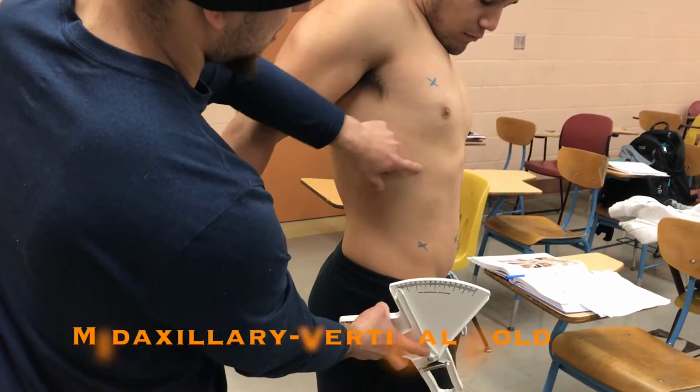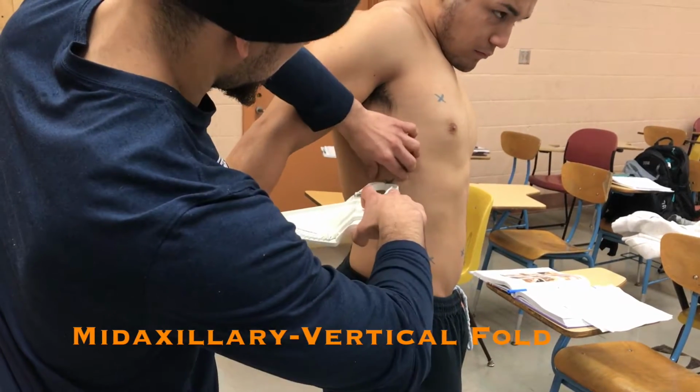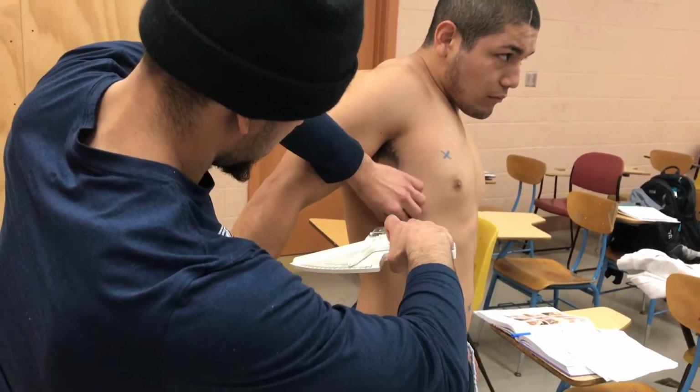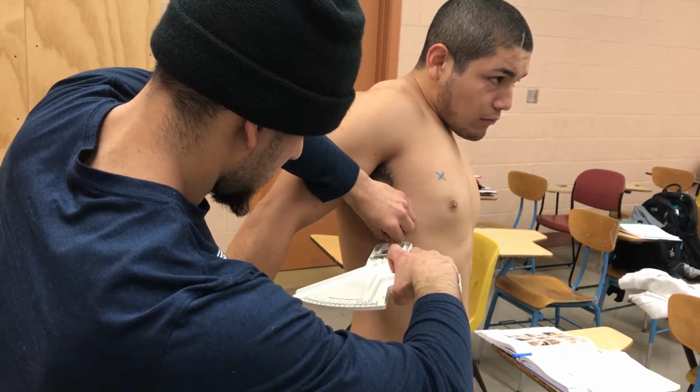For the mid-axillary site, have the client hyperextend their arm. The mid-axillary line should be marked and level with the client's xiphoid process of the sternum. It is a vertical fold. Obtain the reading, then release after 1 to 2 seconds.